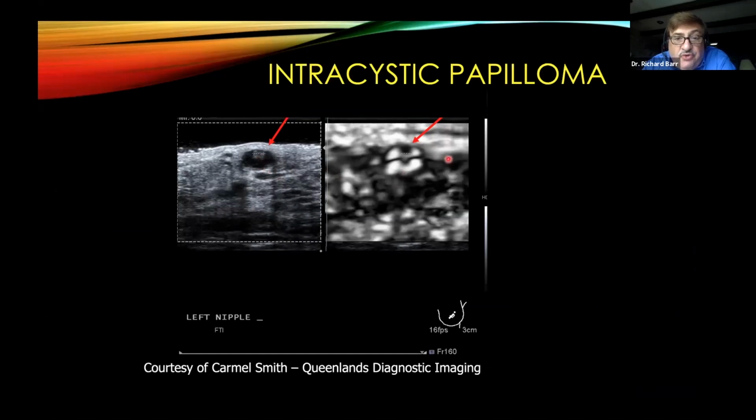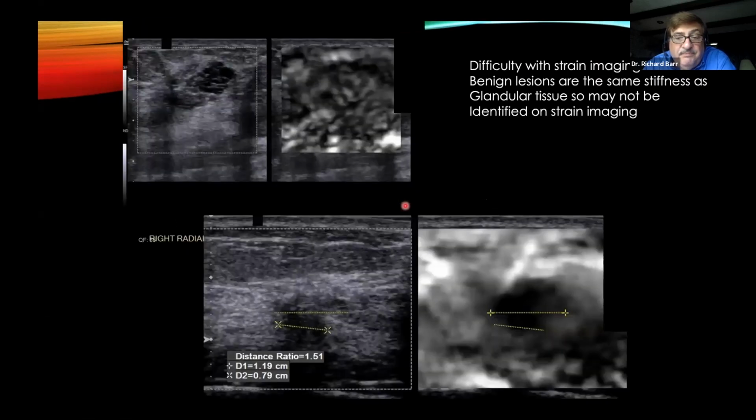So you can see you can get great imaging if you have good technique. And you'll notice that we have the bullseye from the cystic part, but this solid component shows up as a solid component. So using this technique, we can distinguish complicated cysts where everything is moving inside and there's nothing fixed, gives us a perfect bullseye, versus a complicated cystic mass where the non-moving part doesn't mean that it's a malignancy, it's just that it's not moving, will show up as a defect. So this raises our suspicion that we need to do additional either follow-up or biopsy of these lesions.